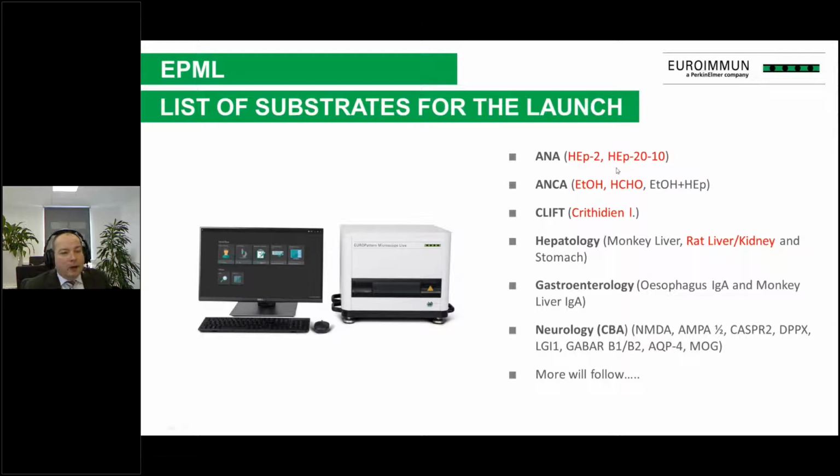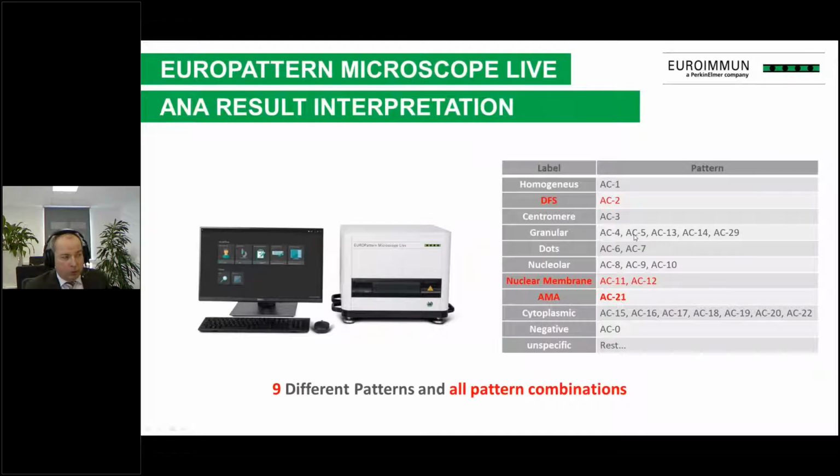The substrates in red can also be evaluated automatically, and I would like to explain to you how it works now.